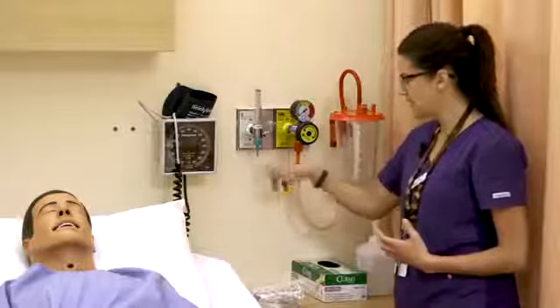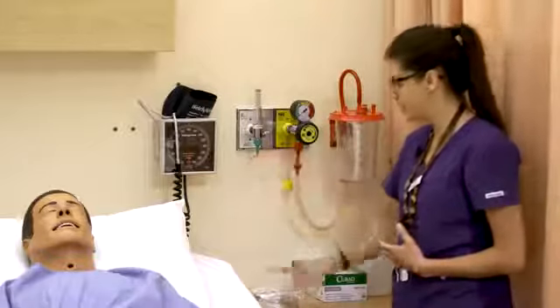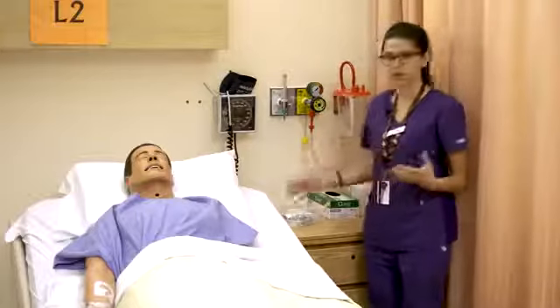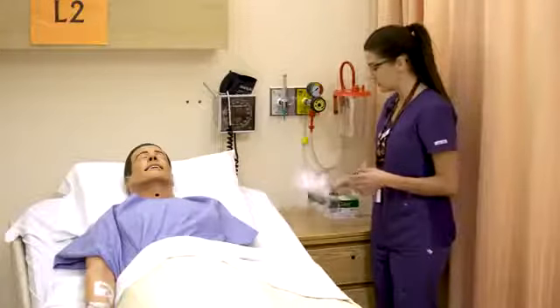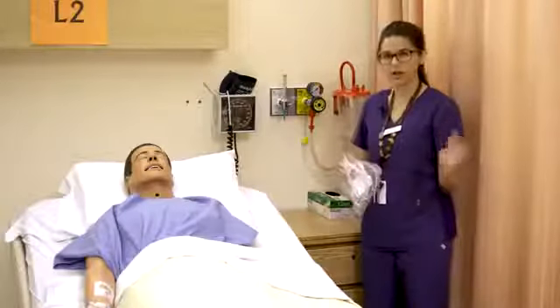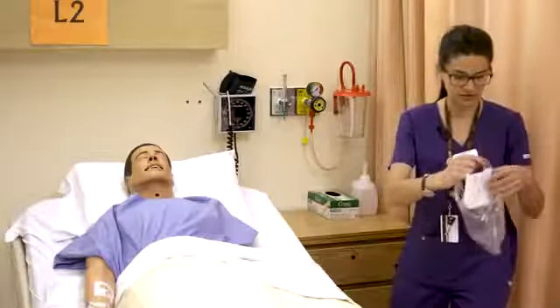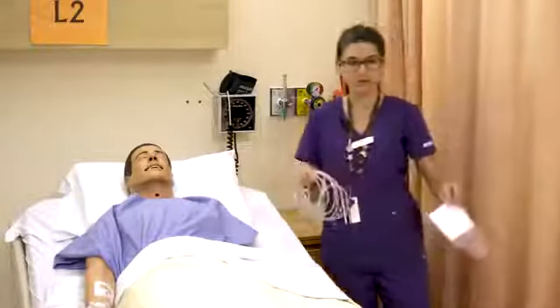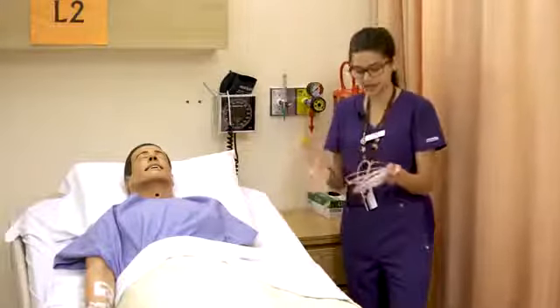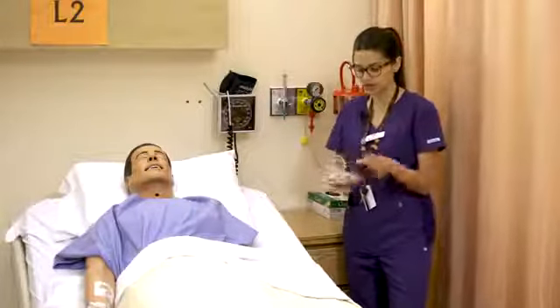This is going to be the place where we connect a lot of the different oxygen types of tubing. Starting with the least, and we'll work our way up, we'll start with basic nasal prongs. Nasal prongs, or nasal cannula as they're referred to, can go anywhere from 1 to 6 liters per minute, and they deliver an FiO2 of 24 to 44%. So I'll just get rid of that. They come in a bag just like that, and I think it's obvious, but they are per patient use, so you wouldn't want to share these among people even if you clean them.